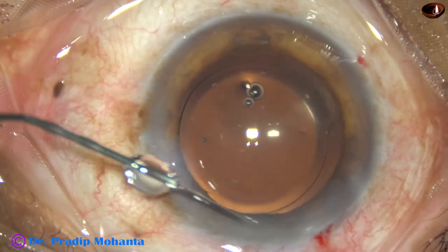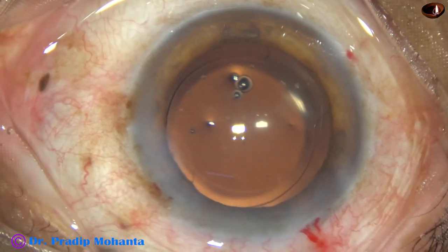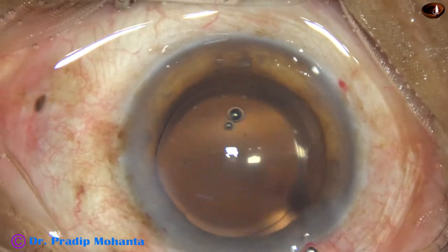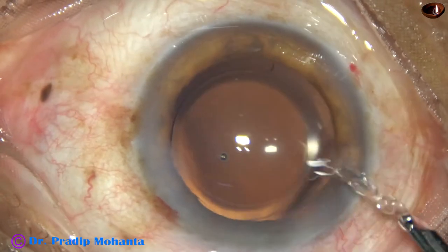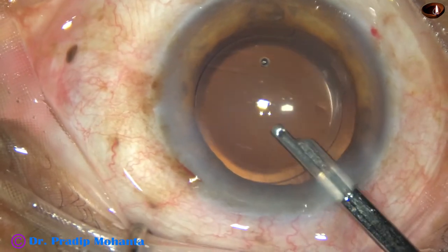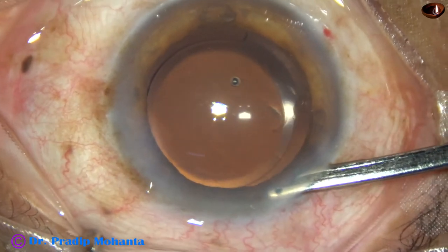Now the side ports are closed by corneal stromal hydration, and then a final lavage of the anterior chamber is done. Whatever visco remains attached to or sticking to the corneal endothelium comes out. The anterior chamber is nicely formed and the case is concluded.